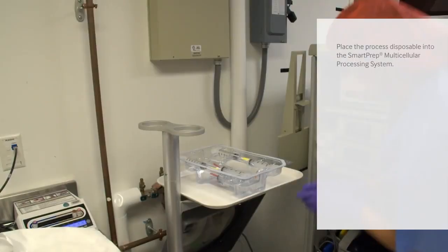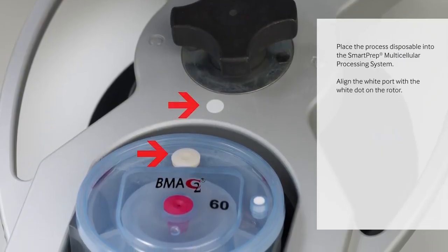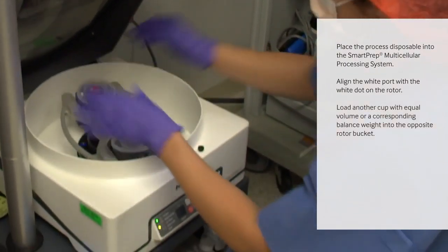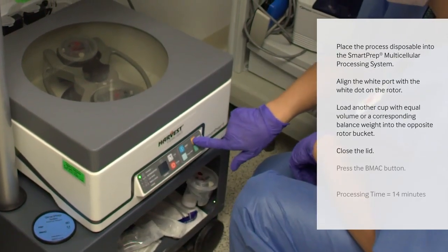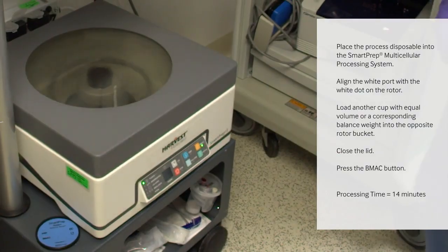Place the process disposable into the SmartPrep system. Align the white port with the white dot. Load another cup with equal volume or a corresponding balance weight into the opposite rotor bucket. Close the lid and press the BMAC button. The total processing time is about 14 minutes.